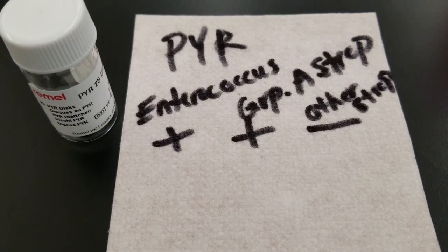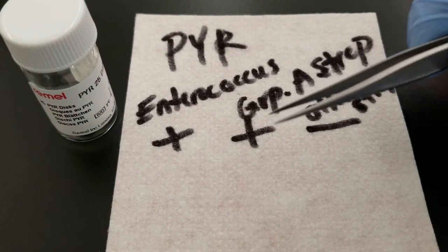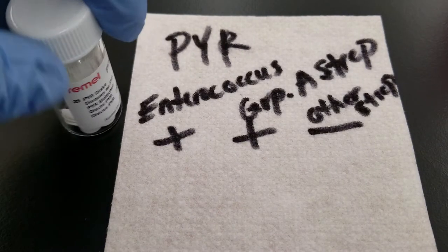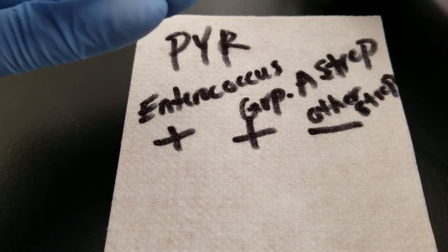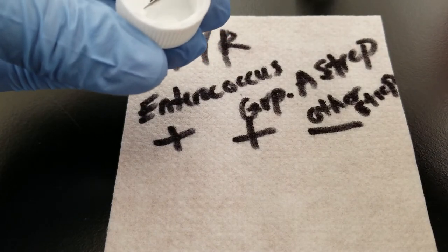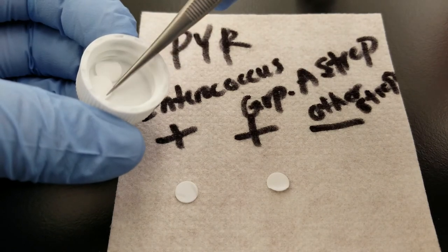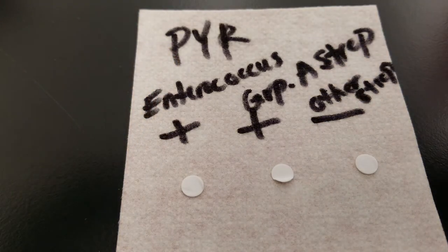I have located a pair of forceps or tweezers — you can use either. I have cleaned it with an alcohol prep pad. We're going to pull out a reagent test filter paper for each organism that we're going to test. If you use your fingers, you need to make sure that your gloves are dry and clean. We're doing this on an absorbent pad.